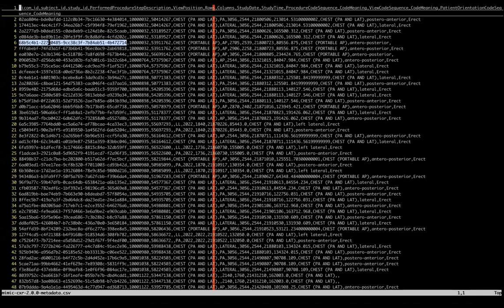When you go through the study IDs and there are multiple files, or multiple DICOM IDs, for each study ID, you come to the metadata to look up what the view position of each image is. If your image ID is this, then you go to the fifth column and look at the value, which is AP. So that is okay. But if it's lateral or PA or something else, we just throw them out. Okay, cool. Hopefully this is clear.